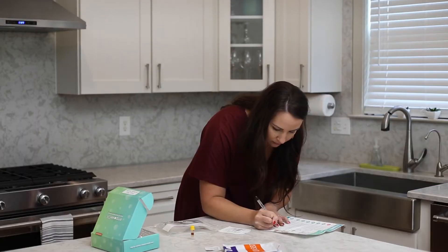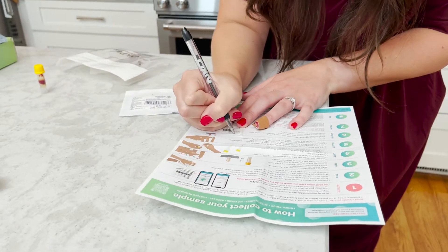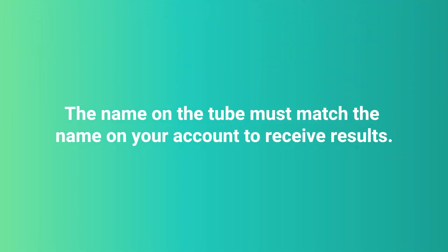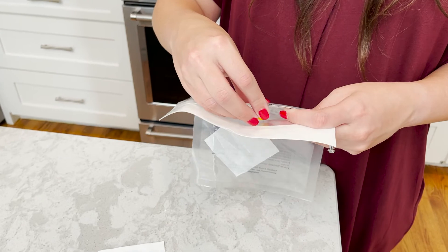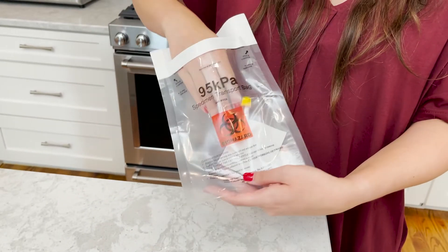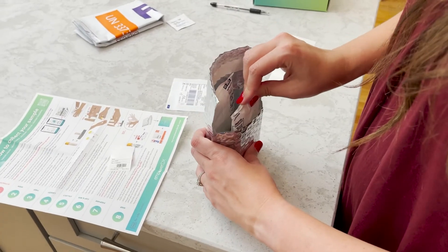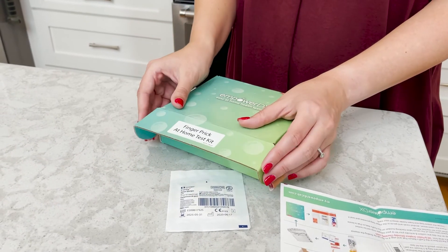Step 7: Prepare. Write your name, date of birth, and date of collection on the name label with a ballpoint pen or permanent marker. The name on the tube must match the name on your account to receive results. Place the label lengthwise on the microtainer tube. Place the microtainer tube in the biohazard bag next to the absorbent pad. Place the biohazard bag and two frozen ice packs in the silver pouch and place the silver pouch in the kit box.